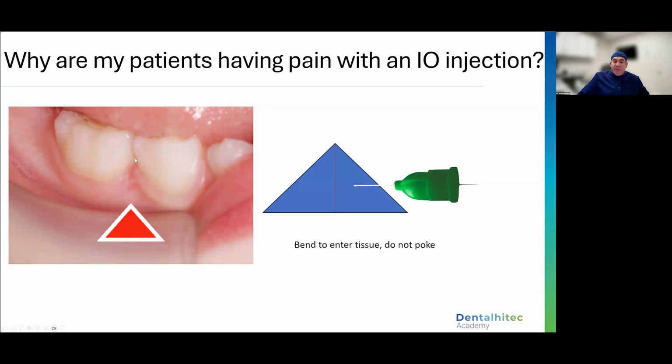We need to remember that instead of entering the tip of your Effitech needle right at the middle of that papilla, I want to go slightly lateral too. The reason is that when you give that first injection, entering the soft tissue, it's easy to get a little heavy-handed and push too far laterally. And we know that the PDL is a highly, highly innervated area.